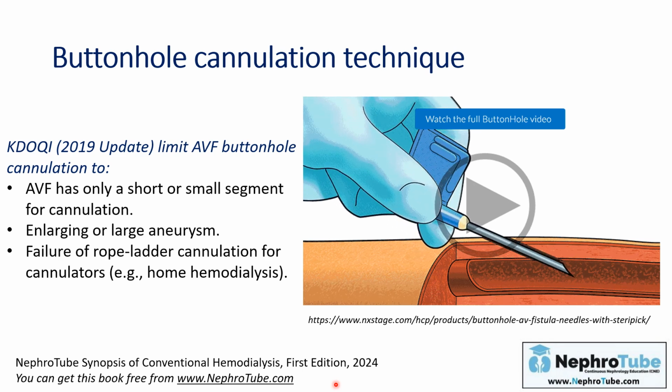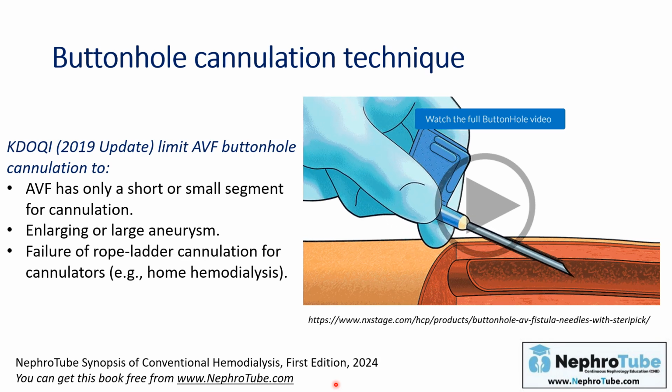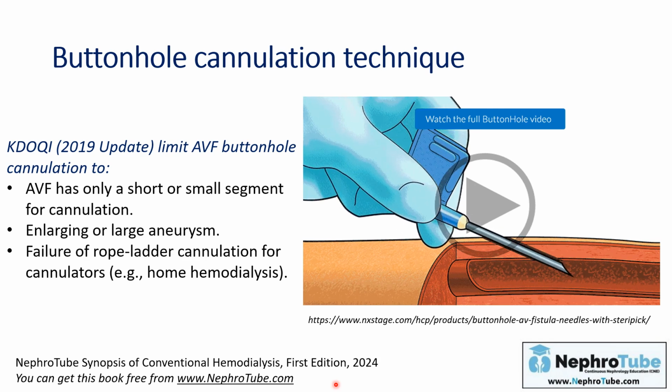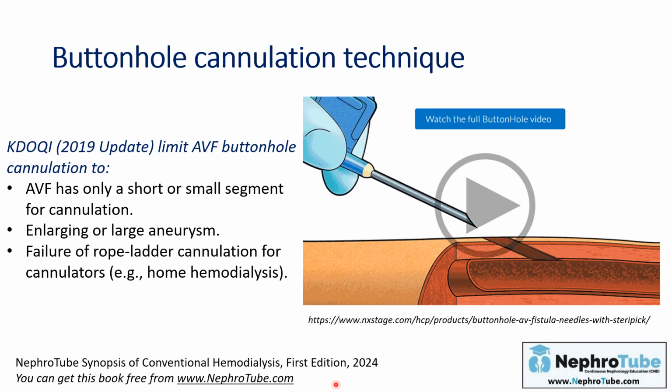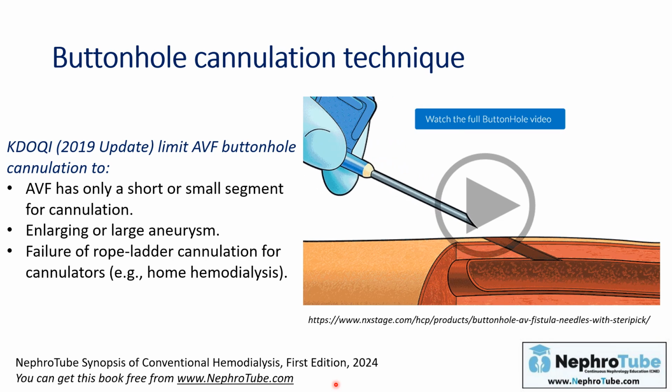The failure of the rope ladder technique is usually very common in patients on home hemodialysis, in which some of the patients cannulate themselves. So in these patients, you can use the buttonhole technique, but it's important to use excellent hygiene and aseptic measures.